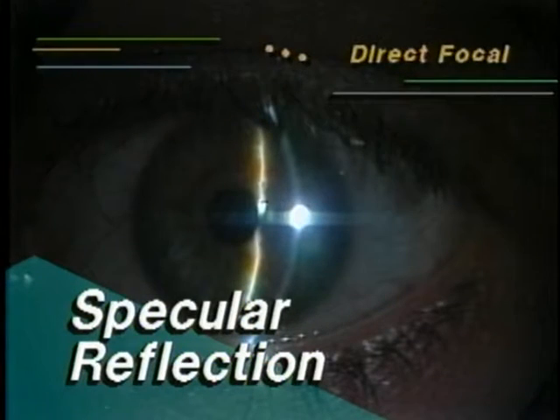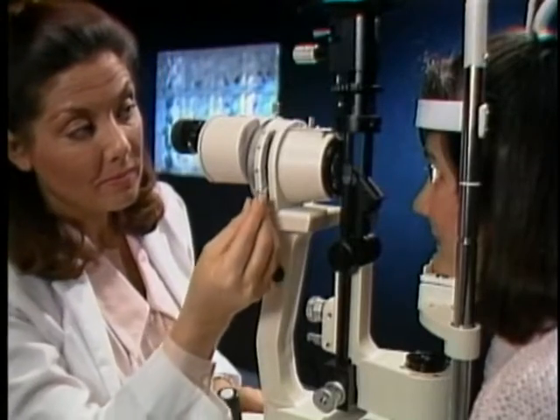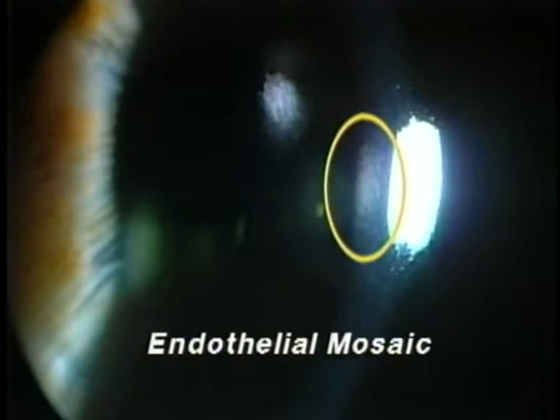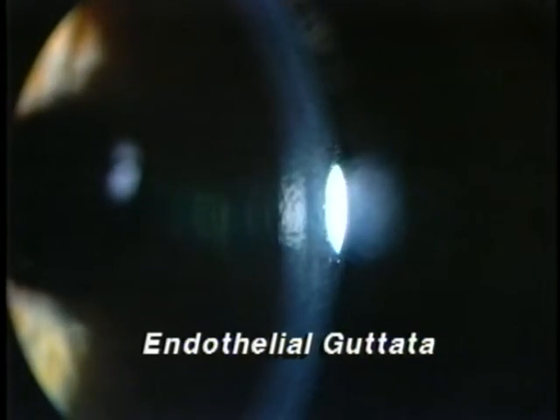Specular reflection is formed by positioning a parallel piped to reflect off the corneal surface. The rheostat is at maximum brightness and the magnification is set initially on low. The light source and microscope are separated to about 45 degrees until a bright specular reflex appears in one ocular — the point where the angle of incidence equals the angle of reflection. Specular reflection is primarily used for viewing the corneal endothelium. Zoom to the highest magnification; a bright image is observed with a duller image adjacent to it. Adjust the joystick slightly to focus the duller image to bring the endothelial mosaic or texture into view. Any irregularity in the endothelial surface is enhanced by this illumination. In this example, endothelial guttata present as small, dark patches in the mosaic reflex — areas of endothelial cell dropout, often caused by contact lens-induced hypoxia.